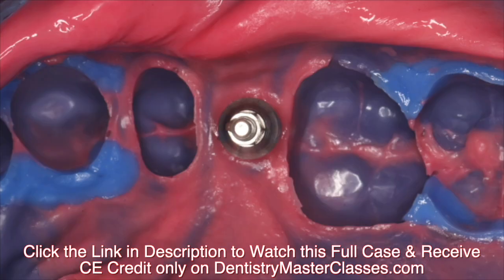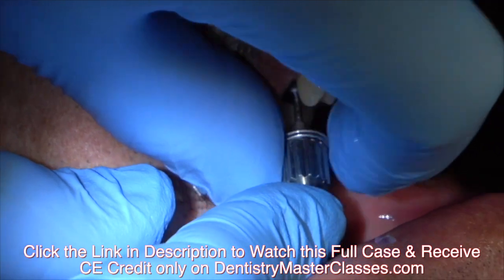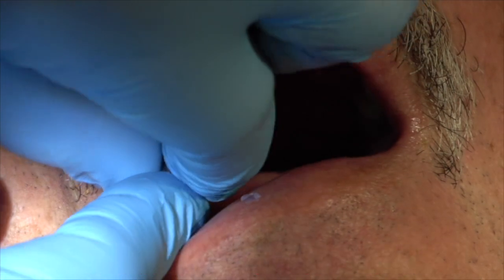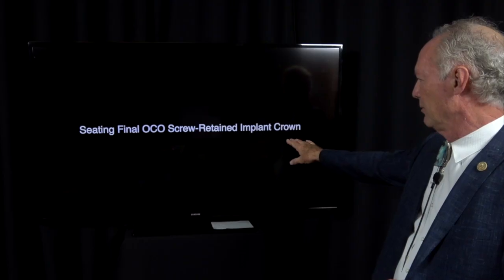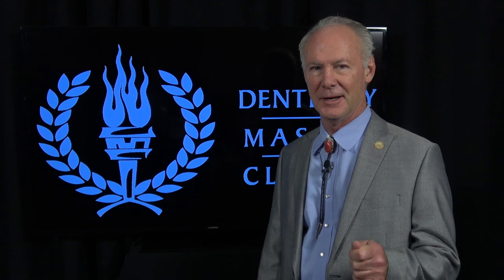I really like this system — it's just easy. Then you're going to put the healing abutment back on the implant, just finger tighten it. Now we're going to seat the retained implant crown and abutment. These techniques work and they work every time.